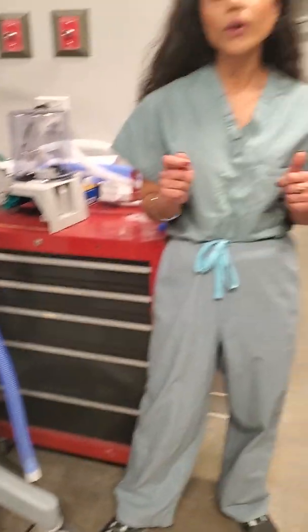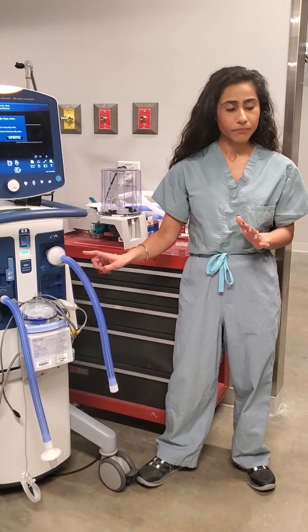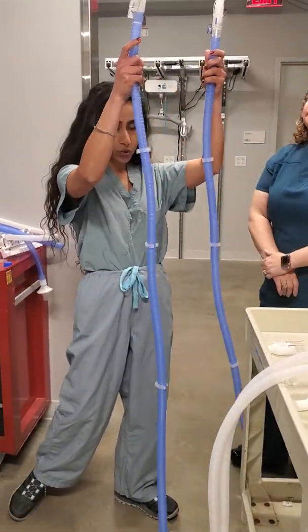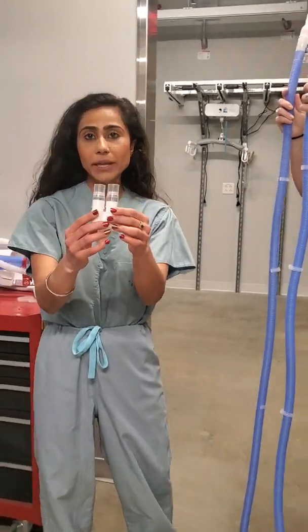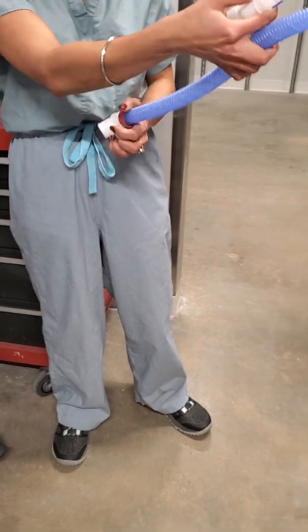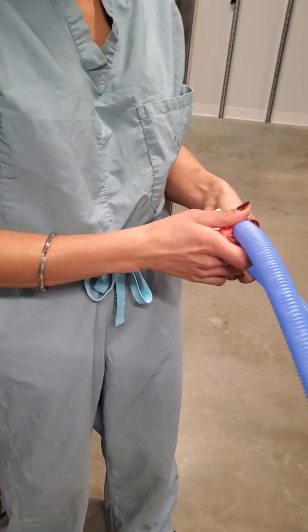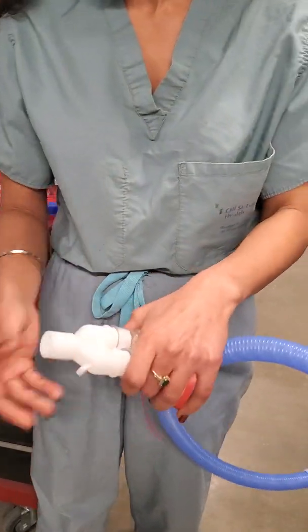Step one: we are going to connect two separate inspiratory circuits onto one single inspiratory limb. Here we have two separate inspiratory circuits and we're going to be using this Y piece. You can see I've already connected a one-way valve onto each end of the Y piece. This Y piece will then connect to the inspiratory limb.